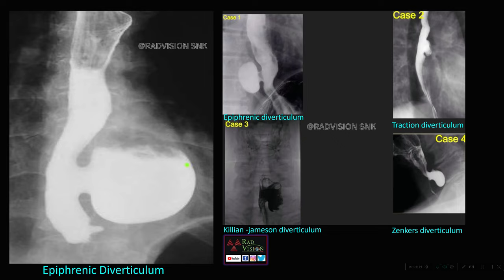This next case shows a large outpouching arising from the lower one-third of the esophagus just above the diaphragm — this is a case of epiphrenic diverticulum. I will try to show all four types of diverticula for your reference. This is epiphrenic diverticulum just above the diaphragm; this is traction diverticulum noted in the middle one-third of the esophagus.